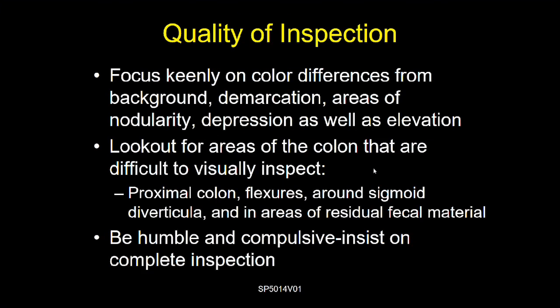So some tips about the quality of inspection. We're going to focus when we do this on the color differences from the background compared to the polyp, looking for sharp areas of demarcation, any areas of nodularity, or areas where the surface tends to depress or elevate.